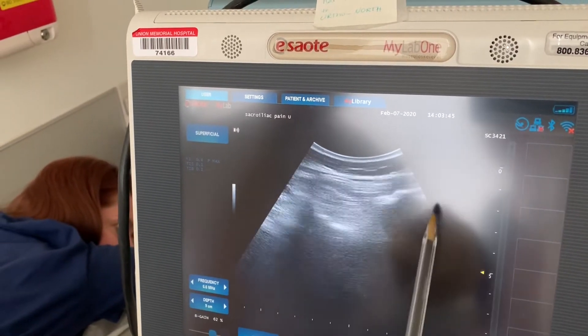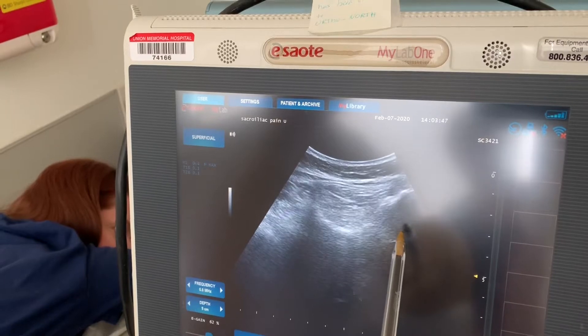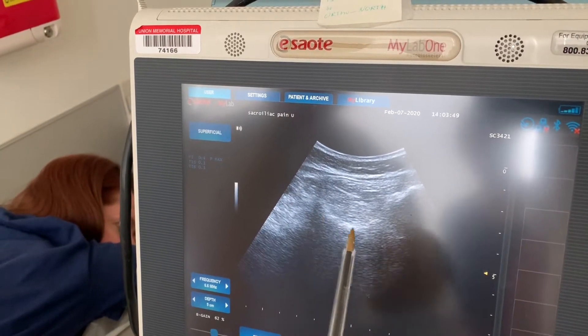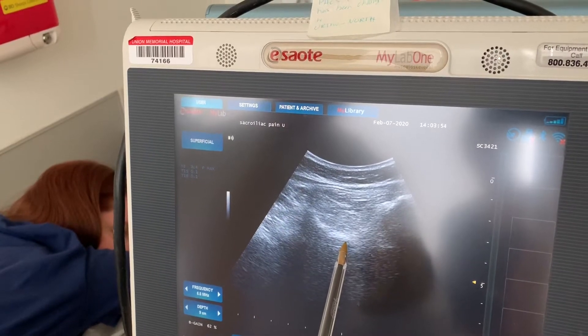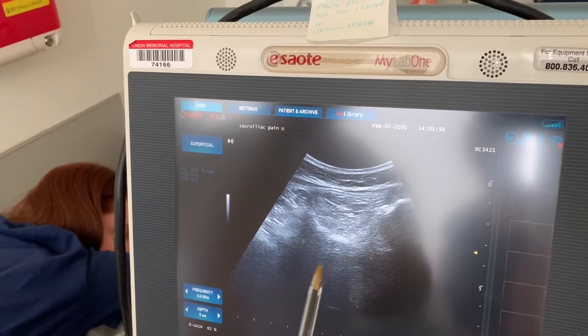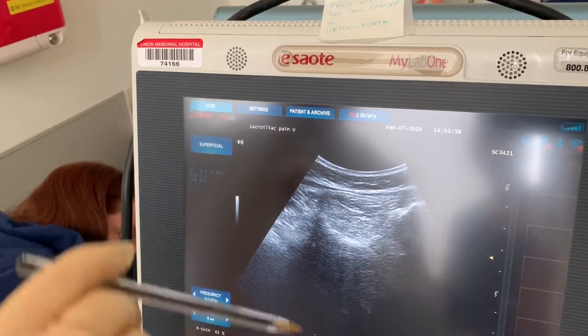It is important to identify these landmarks correctly, because if you place the needle too medial, you're going to end up doing a transforaminal S1 injection instead of a sacroiliac joint injection.